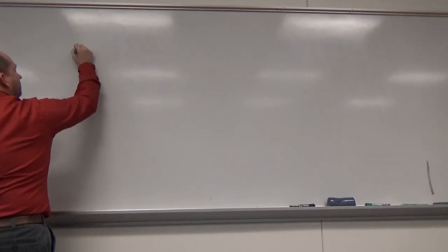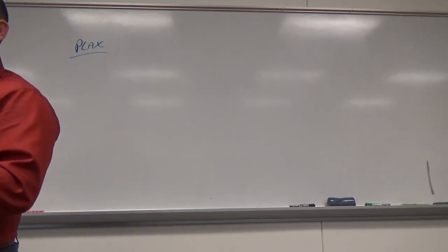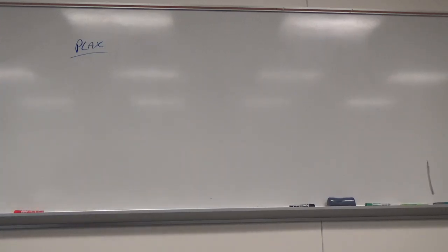Okay, so parasternal long axis. Remember I said that you always take a 2D cine of whatever you're looking at. Then, if you need measurements, you're going to stop and take measurements. And then you're going to take still pictures of those. Some of them are going to be in systole, some in diastole, so the timing of it and scrolling to those parts is important, lined up with your EKG. And then you're going to do color Doppler on it with a clip, and then a spectral Doppler with measurements if needed. So it all depends on what we're looking at that moment.